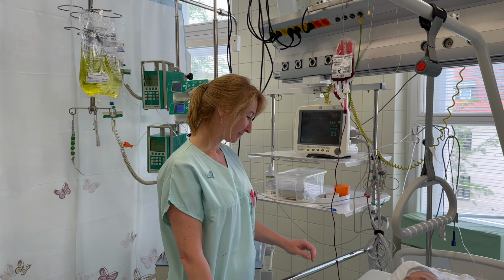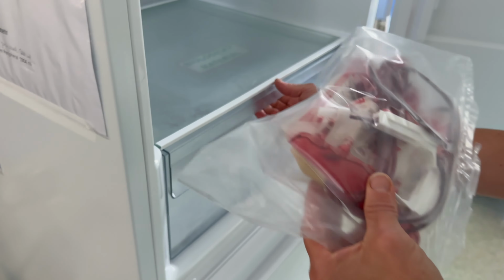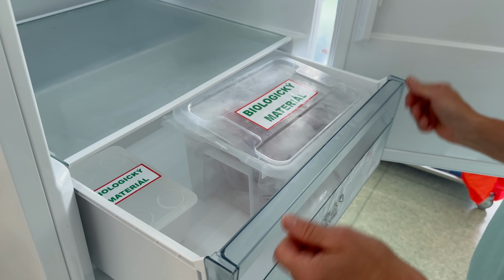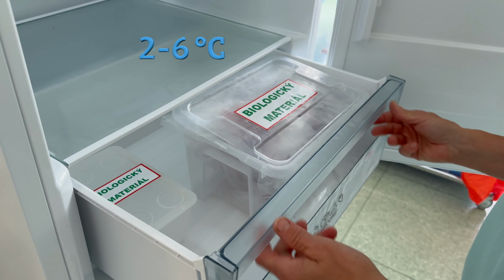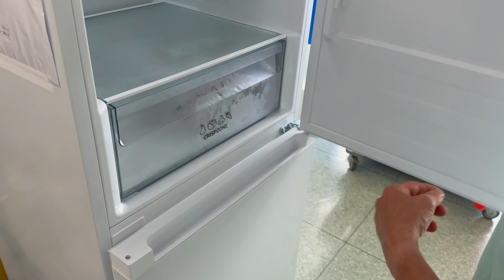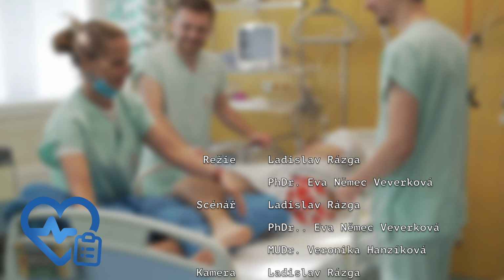The transfusion is ended when approximately 10 to 15 milliliters of the product remain in the bag and the line is clamped. If intravenous access needs to be maintained, the line is flushed with 20 milliliters of saline using the start-stop method. After the transfusion set is sealed, protected against contamination, and stored in a refrigerator at 2 to 6 degrees Celsius in a separate labeled compartment designated for biological material for a period of 24 hours. The values of the patient's vital signs after completion are recorded in the documentation.